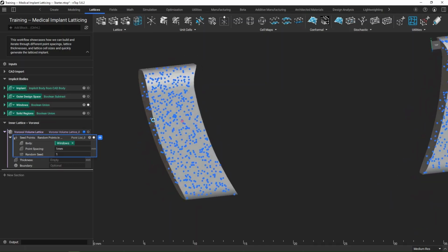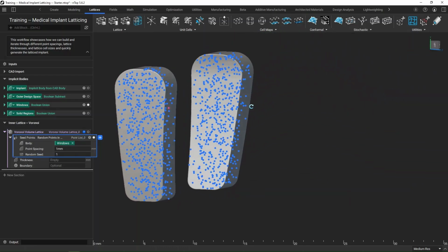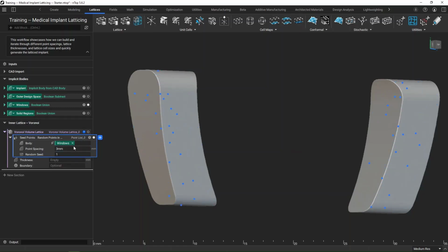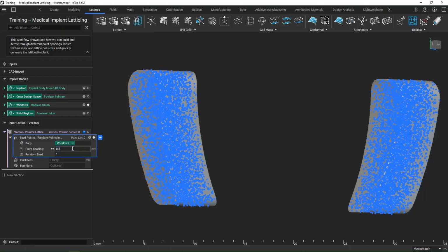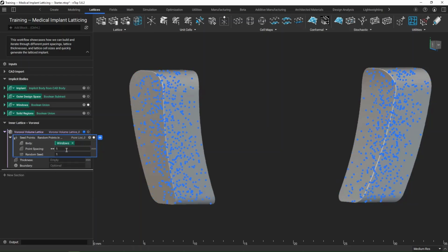This is going to be the seeds in which my Voronoi lattice is going to be generated around. So each of these are going to be the middle of one of those Voronoi pockets. And so that looks pretty good for me. If we wanted it to be greater or more spaced out, I could bump that up quite a bit. Or maybe we want it to be even more dense. And you can see how it's affected. But I'll stick with that 1 millimeter point spacing.